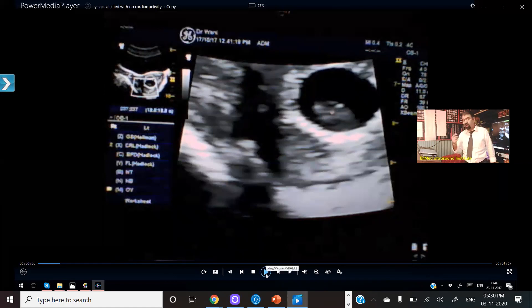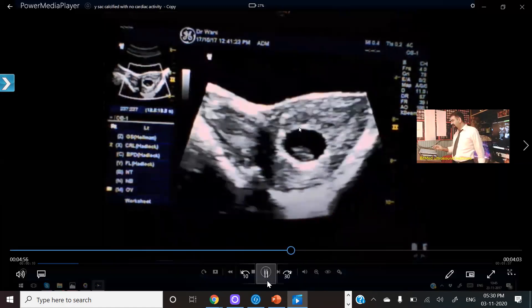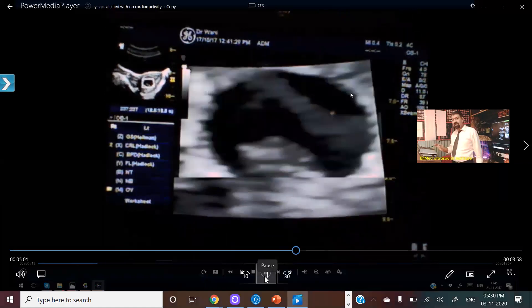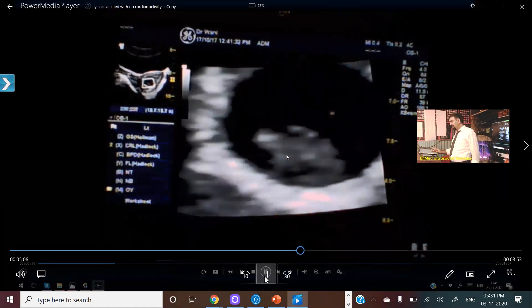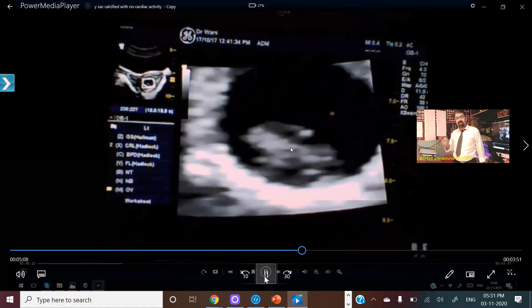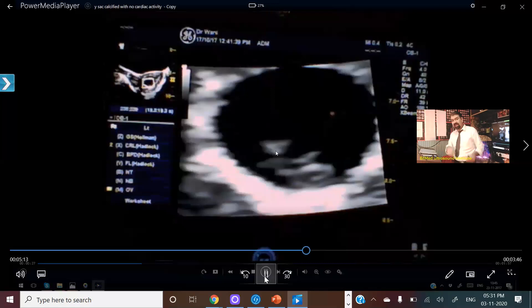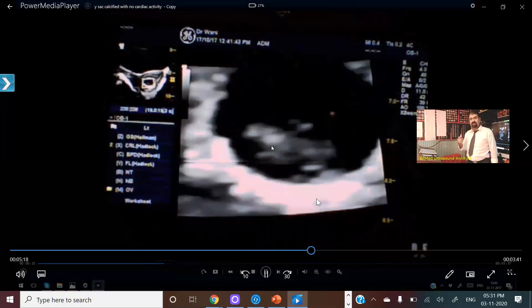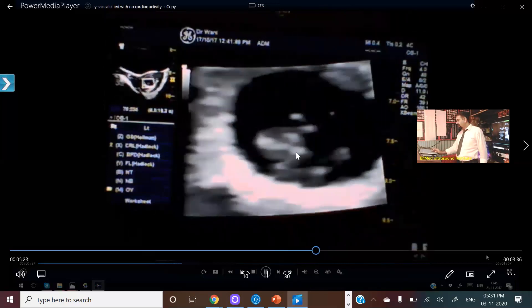And maybe the yolk sac is not there. If the yolk sac is not there, that is also giving you a clue that you are dealing with a dead fetus. And if the yolk sac is there and the yolk sac is calcified, it means I am dealing with an abnormal yolk sac — again going in favor of an abnormal pregnancy. And whatever I was missing, the fetal heart, I am confirming I am on the right track.